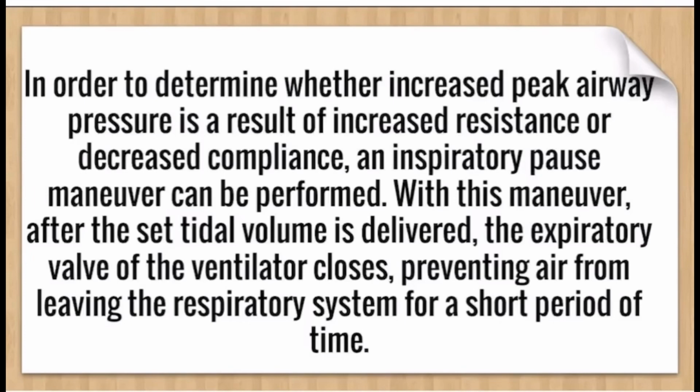Now, in order to determine whether increased peak airway pressure is a result of increased resistance or decreased compliance, an inspiratory pause maneuver can be performed. With this maneuver, after the set tidal volume is delivered, the expiratory valve of the ventilator closes, preventing air from leaving the respiratory system for a short period of time.